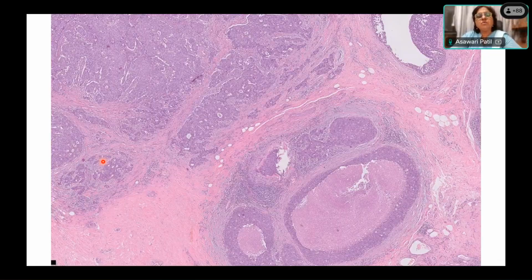Microinvasive carcinoma, when you say, you comment on nuclear grade. Remember that focus is too small to give a modified Bloom-Richardson score. But you can definitely comment on the nuclear grade, whether it is high nuclear grade, nuclear grade 3 versus 2, right? It's rarely going to be 1. It's going to be either 2 or 3, almost always 3. So comment on nuclear grade, comment on size of the microinvasive carcinoma less than 1 mm, and comment on the DCIS, what type of DCIS it is. Is that clear how to report it?